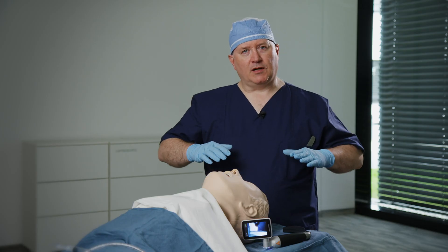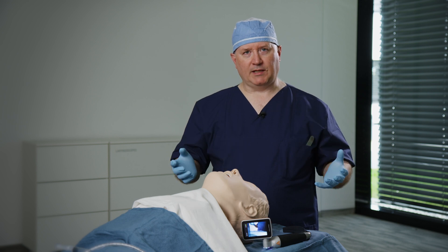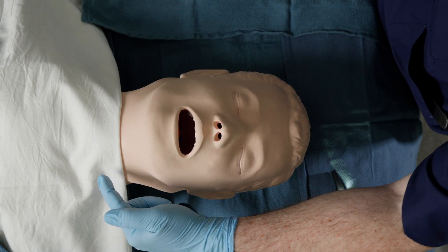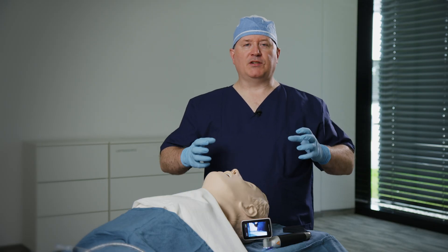To begin this discussion, we're going to talk about the methods by which to properly and optimally perform an intubation. I'm going to begin by positioning my simulated patient. The patient in this case has an ear equal to the level of their sternal notch, which is doubly important, especially in obese patients.